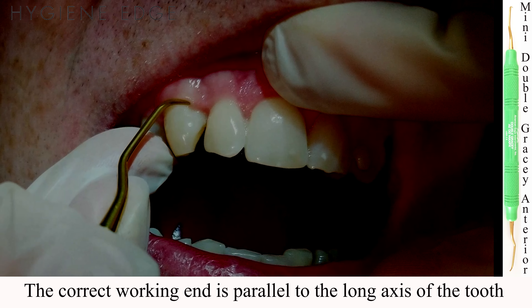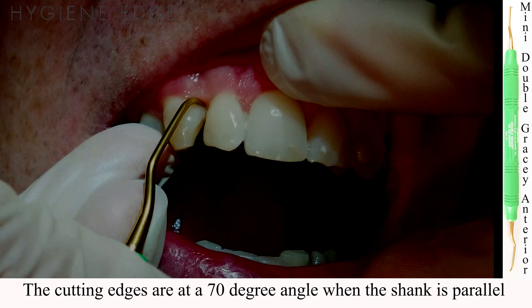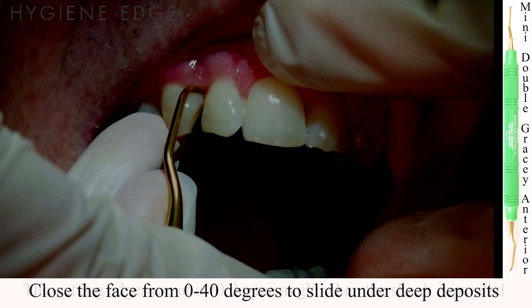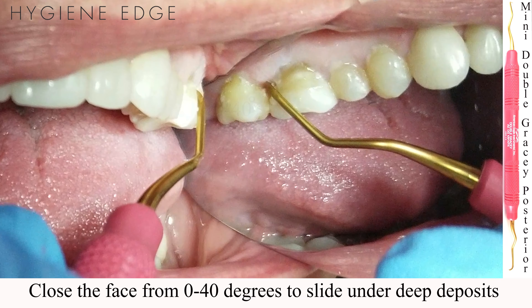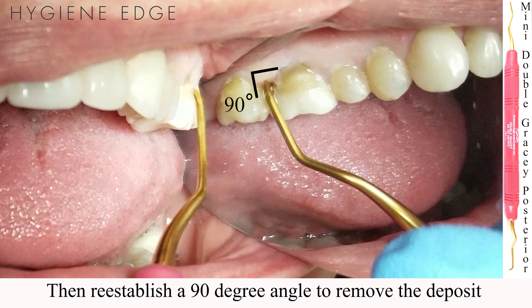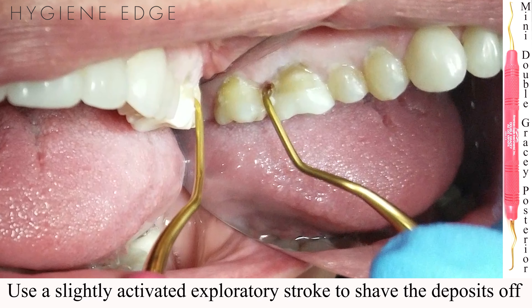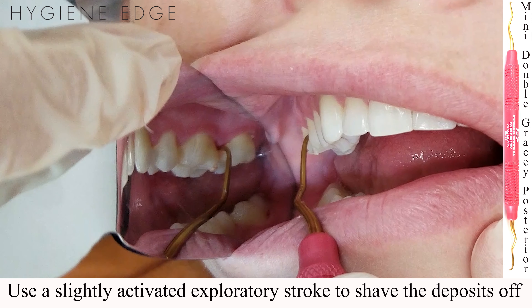The cutting edge is already adapted for removal at a 70 degree angle when the shank is parallel. If entering a deep pocket with deposits, slide the instrument at a 0 to 40 degree angle under the deposit. Establish a 90 degree parallel shank, then with the XP Sharpen Free technology use an exploratory-like stroke to shave the calculus off from the outside of the deposit until you reach tooth structure.